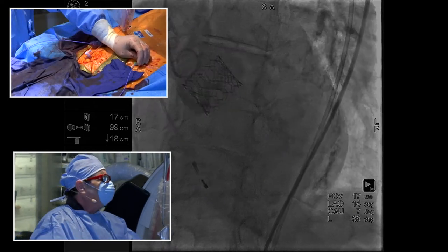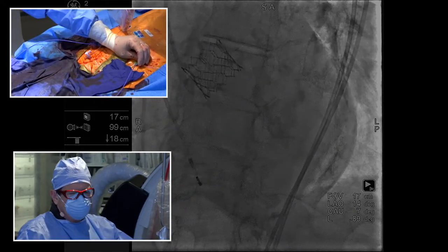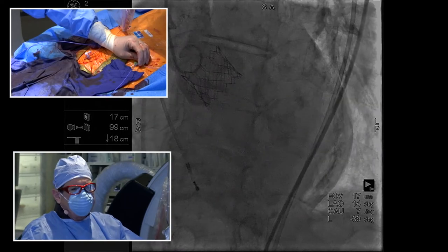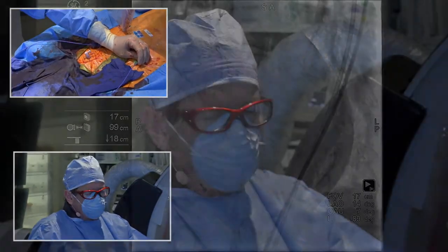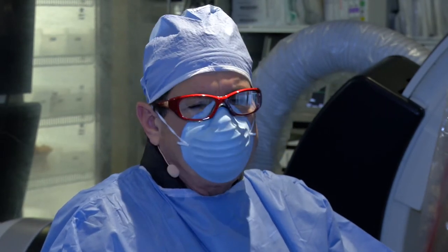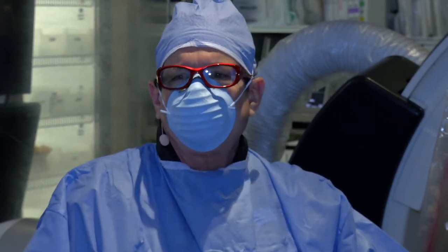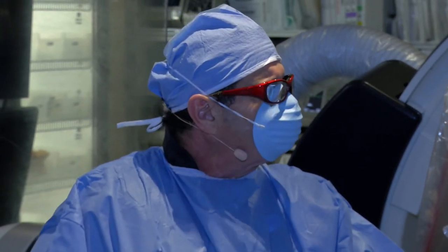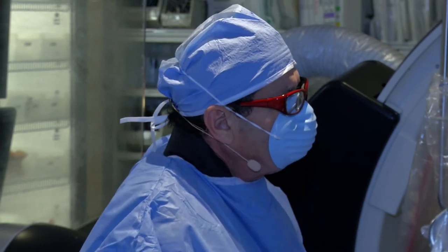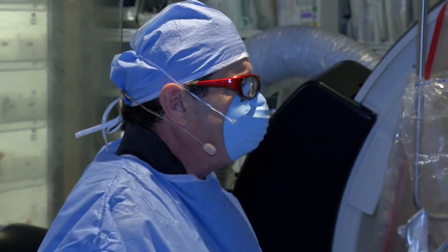All right, so what's going on here is there's a chunk of calcium in the LVOT, and with the Edwards valve, if you post-dilate it, you can make a hole in the annulus, and that is usually a lethal occurrence. I mean, at least half the time it's lethal. So there's a risk of that. And so the question is, is this enough leak? It usually gets better over time too.